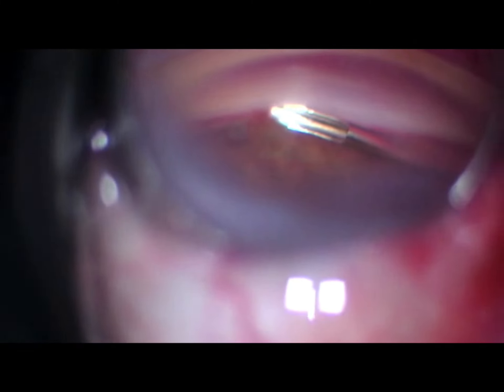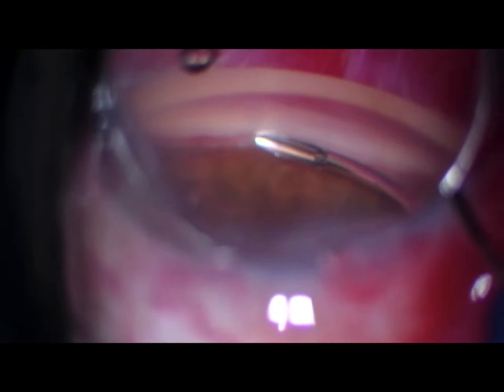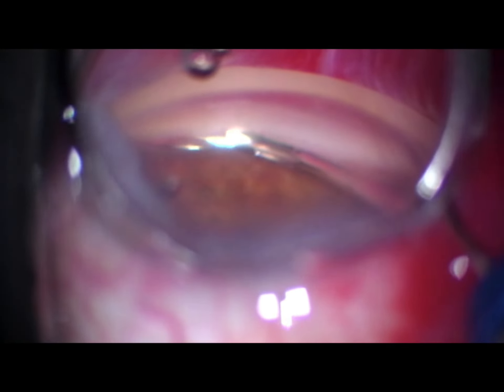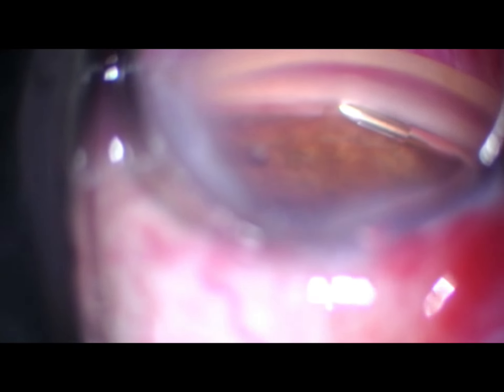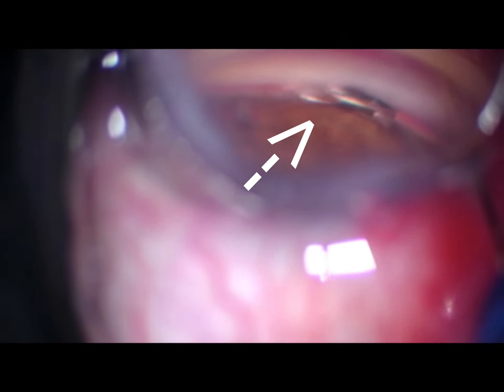Now you can see I'll do a little dimpling, but the view is not great and the angulation is not great. I make a partial attempt and then realize I've got everything lined up poorly — so I stop and ask the patient to reposition. I put it in and I thought it was good, but then I saw something I did not like. I reposition — notice the dimpling — there's that z-axis correction. Now I like it a lot.